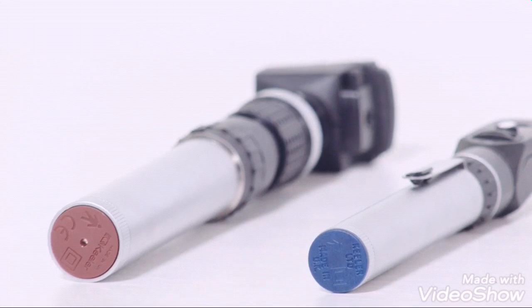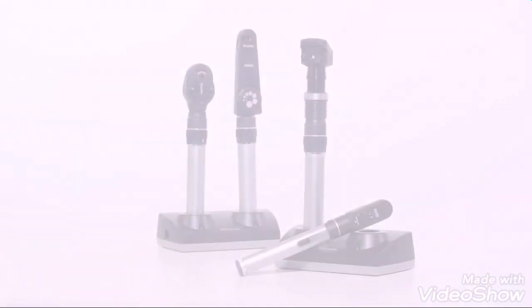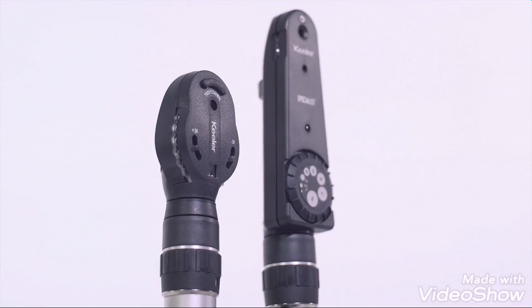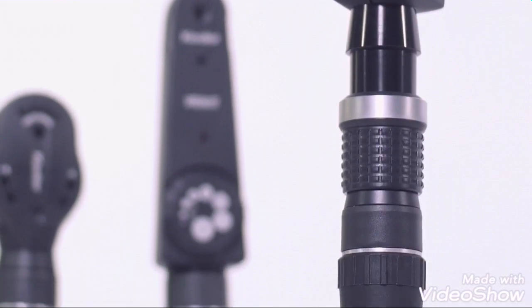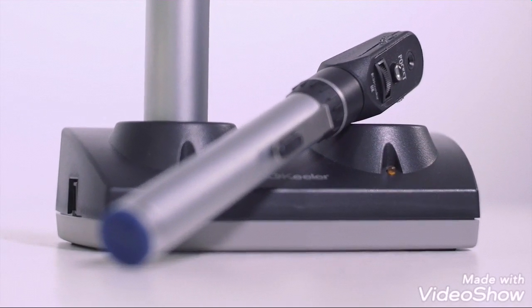Keeler rechargeable handles have a red base and dry cell battery handles have a blue base. Keeler handheld diagnostic tools are light, comfortable, and built to last. Our renowned optical system offers the best focus and clearest view. The Keeler customer service team is dedicated to helping in any way we can, so please visit our website or give us a call.